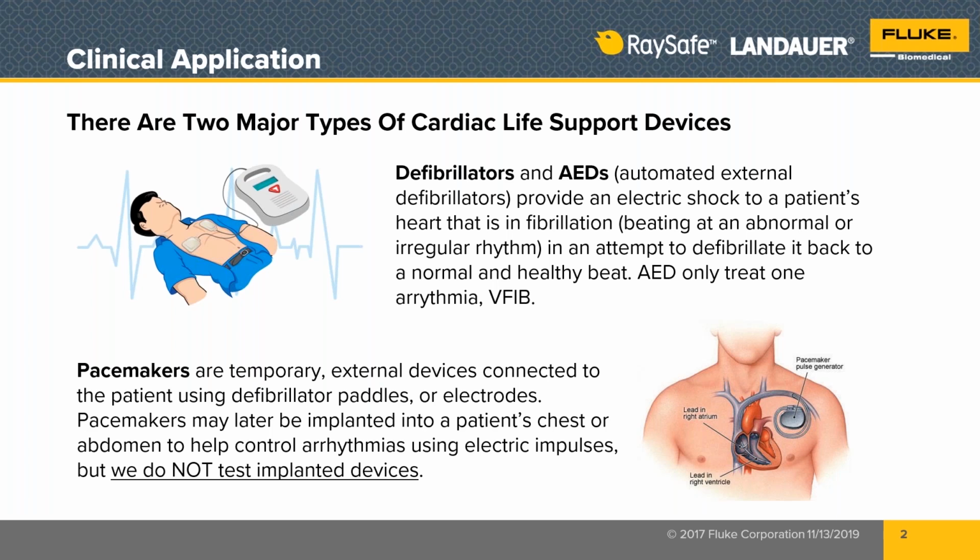Then we also have, especially in the full ACLS defibrillators, pacemakers that are integrated into the design of those defibrillators. The purpose of these pacemakers is a temporary external device that can be used to help the heart rate of a patient be speeded up.